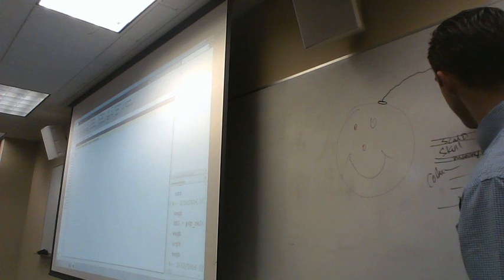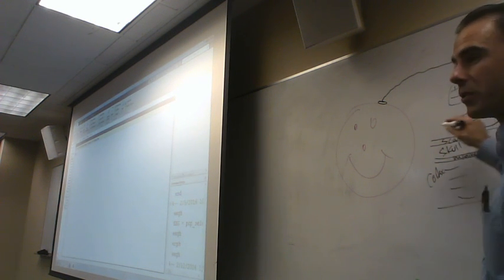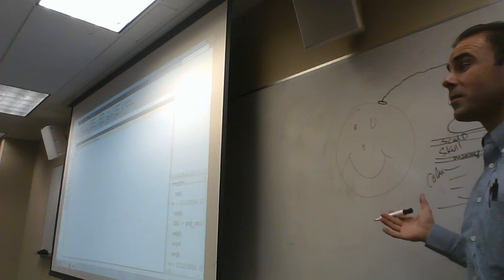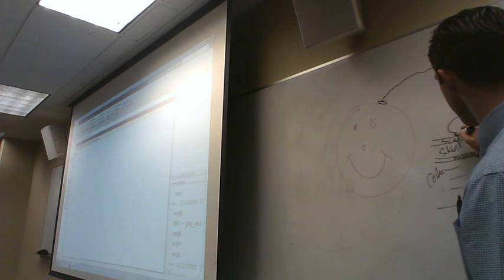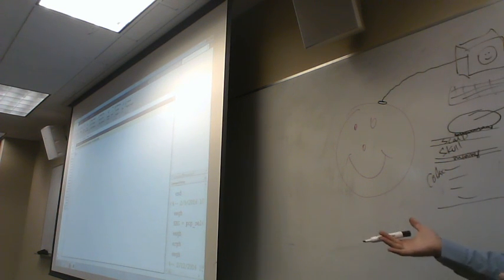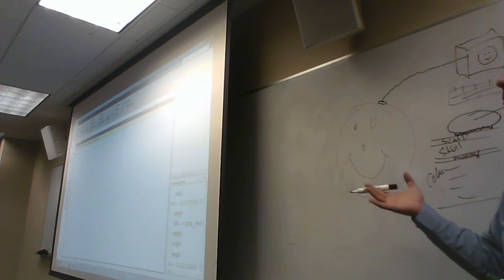And so we're actually recording with our electrode. You guys might remember, we did have a picture like this on the slides. It just looked nicer, because I'm a bad artist. But the point remains the same. This is our electrode, and there's actually a space of air in between here. It's not actually directly even on the scalp, is it? Everybody know what we do to help make that connection then? Yeah, we're going to use conductive gel.